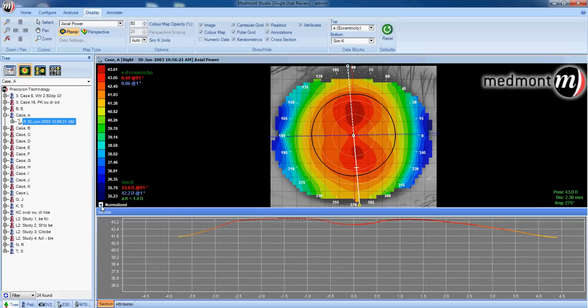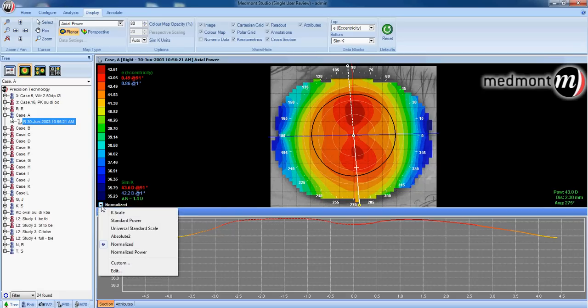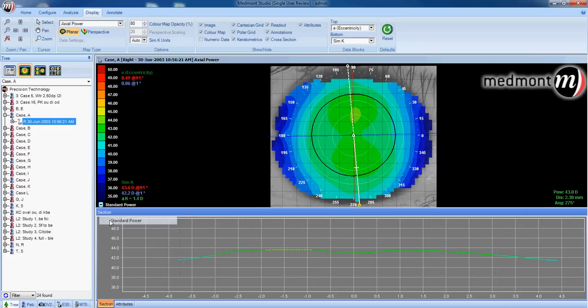You can also click on this down arrow and select from any one of the absolute scales. For instance, we could select the standard power scale which changes the scale range to 35 diopters up to 50 diopters.